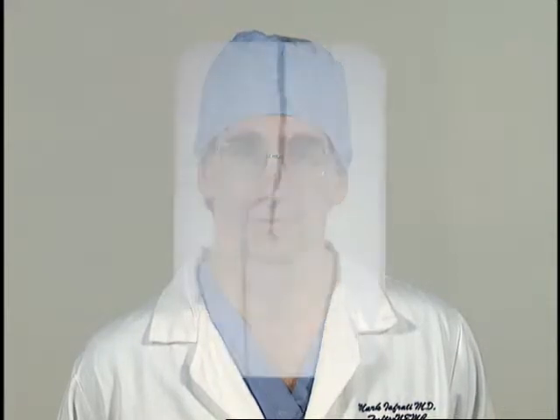Based on your review of the patient's clinical symptoms, your imaging studies, be they MR angio, CT angio, or duplex, or conventional angiogram, combined with your physiologic assessments such as ABIs, TCPO2s, and PVRs, you need to have a plan for an injection strategy prior to entering the operating room.